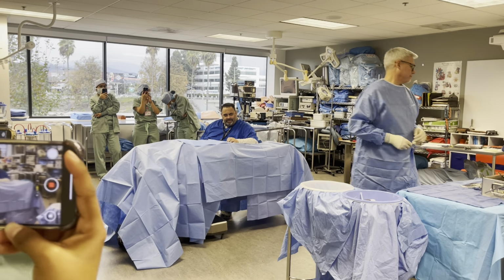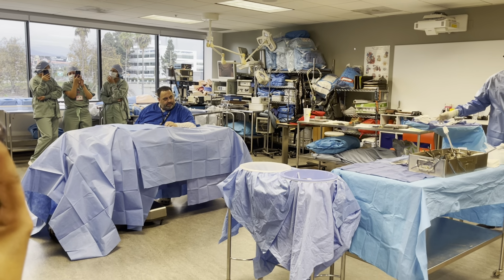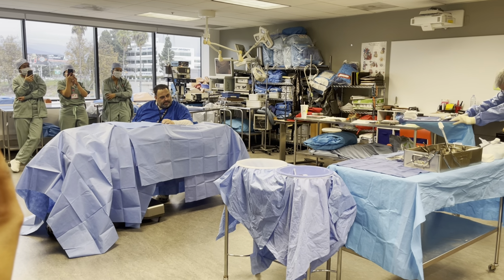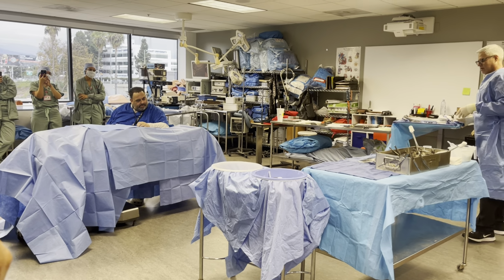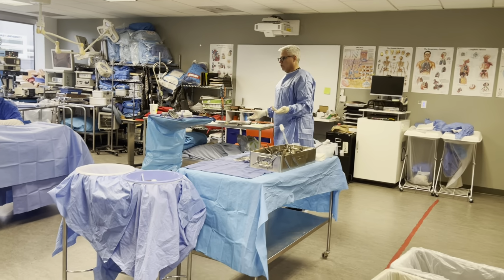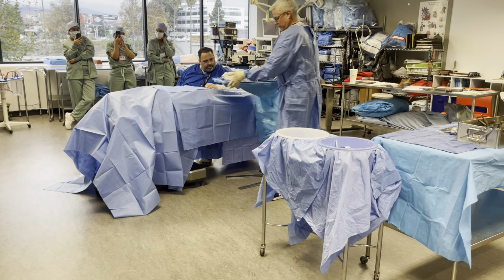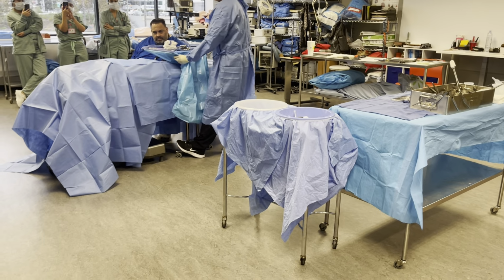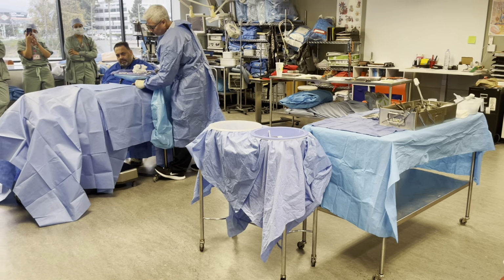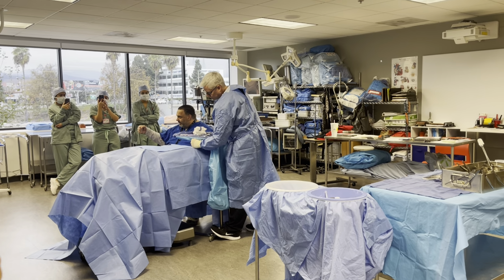Okay. Now that you're all squared off, how do you bring your mayo up? Like this? No. I don't know why we saw the clearance people doing it like that. Look at it. It rolls just fine this way. Okay? No hassle. Get to your table, it goes up. This is how I know my mayo's good. So I can fit my hand under here. You should have at least one hand's width underneath there.